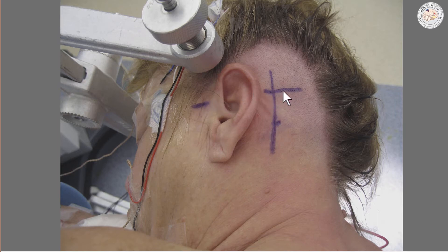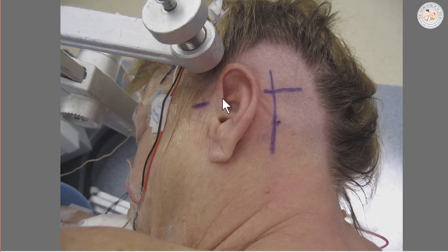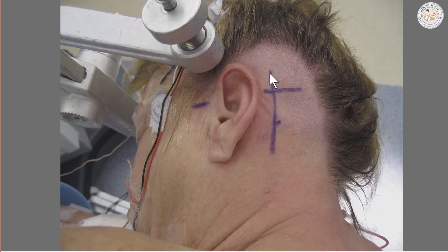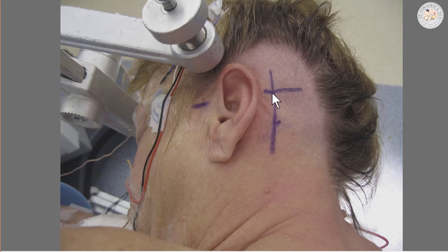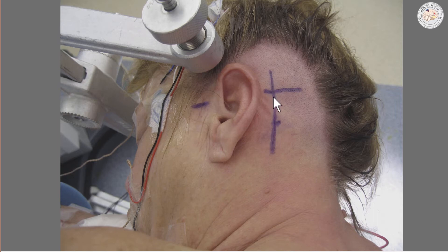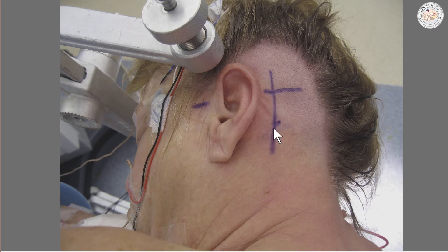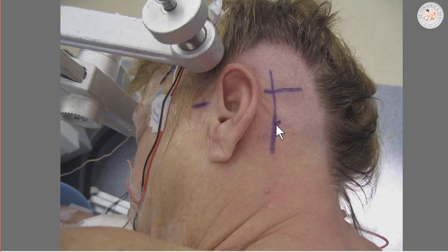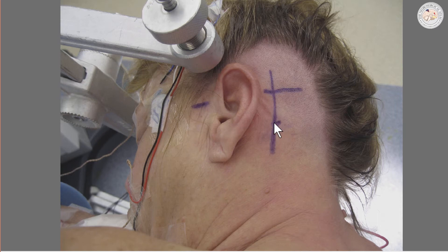This straight line marks approximately the location of the transverse sinus. The planned incision is one-third above the transverse sinus line and two-thirds below this line. This marking most likely describes the location of the mastoid groove.